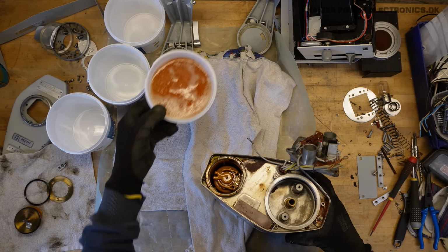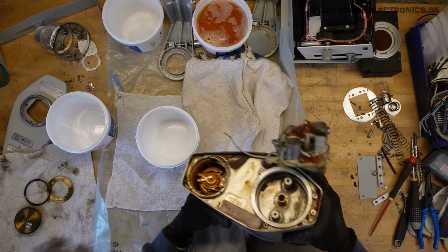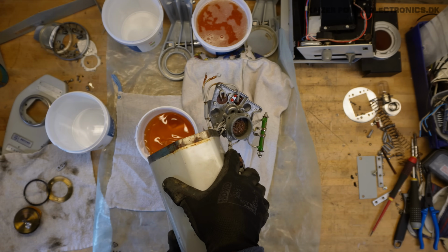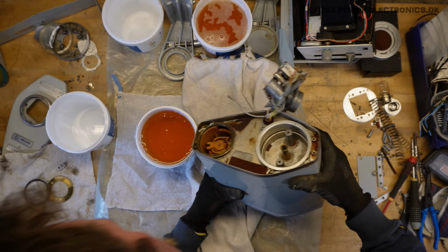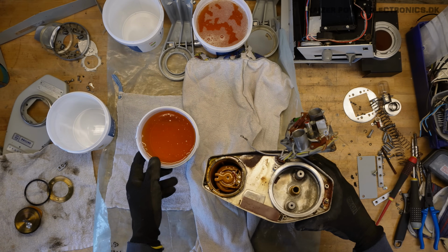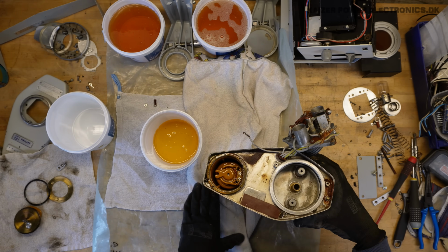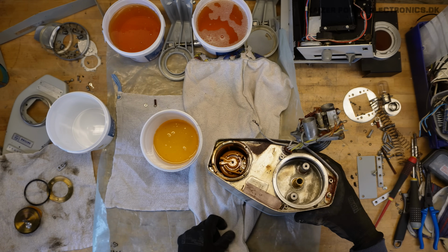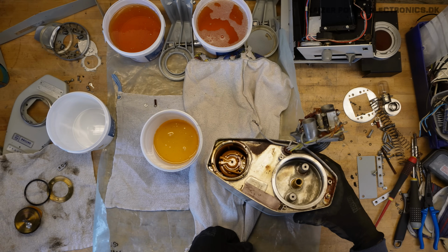Golden oil from a golden age. Okay, there's quite a lot of dirt in that one. Once we start tipping the bottom and getting it shaking a bit, that's about it. Just around 2 liters. Of course, it would have to stand and drip and drain itself for quite a long while before I will try to pry that open.